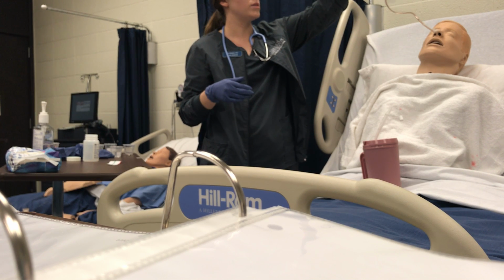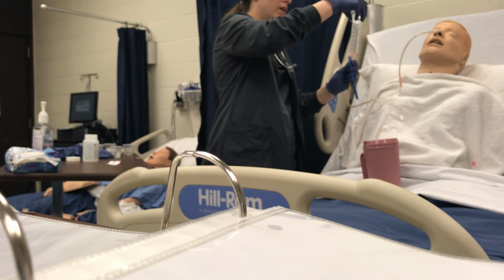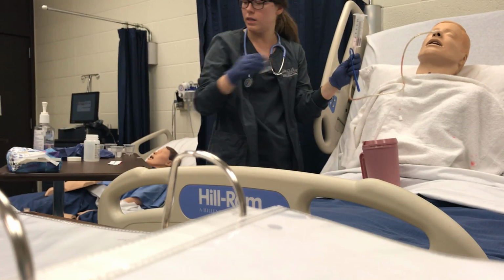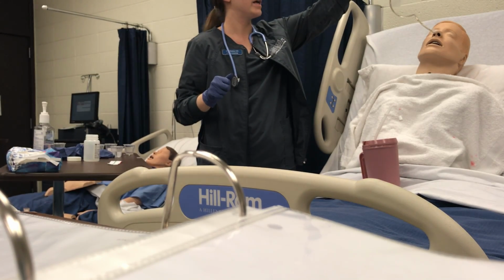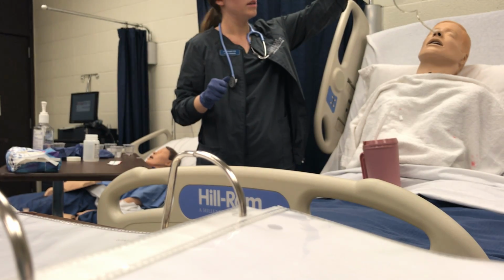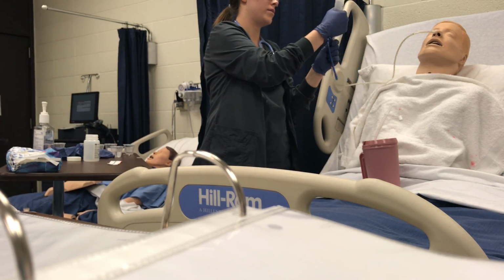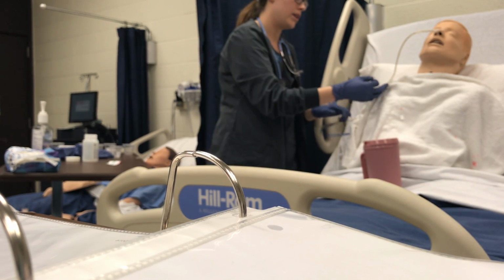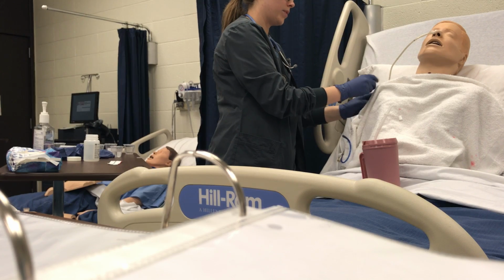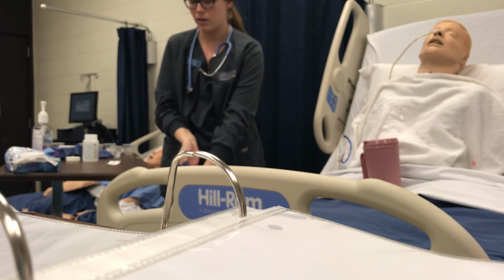And I would be noting this whole time how he's doing with this administration to make sure that it's going okay, that he's tolerating it all right, and any notable information like that I would go ahead and document at the end. That was my last flush. So I would go ahead, I would clamp the tubing, I would resecure it to his gown, and be good to go with that. So I'll go ahead and take my gloves off.